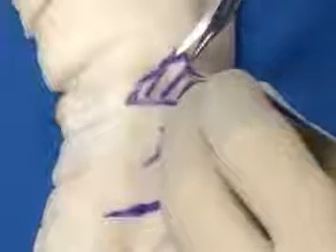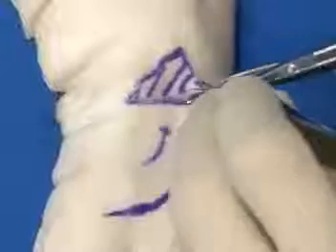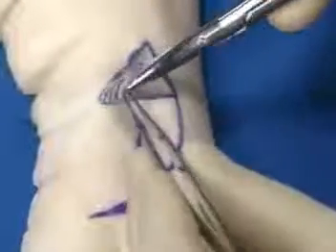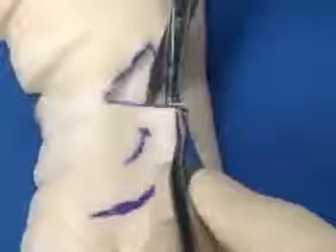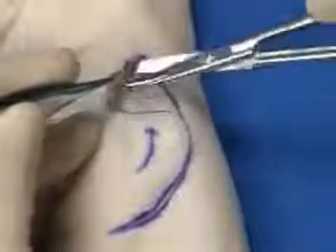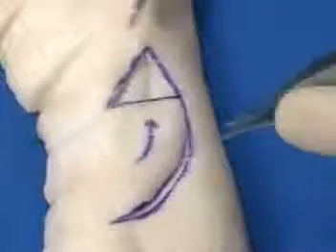This is a flap with a very large vascular pedicle, and it is extremely useful for facial reconstruction. Because the skin edges have already been incised, the defect can be completely excised with scissors. The flap is then incised with a knife, broadly undermined under the entire flap, as well as one to two centimeters beyond the skin edges of the defect.